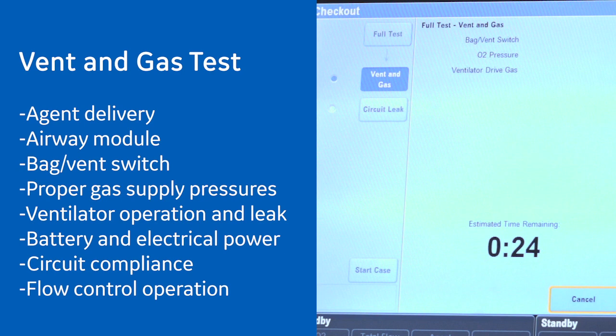The vent and gas portion of the test checks the agent delivery, airway module, bag to vent switch, proper gas supply pressures, ventilator operation and leak, battery and electrical power, circuit compliance and flow control operation.